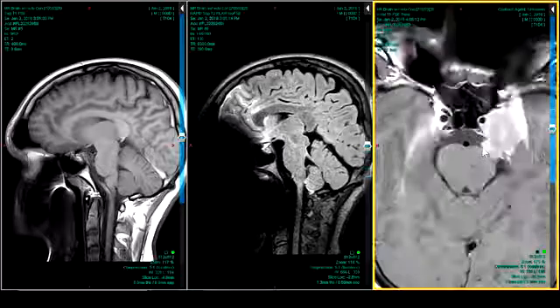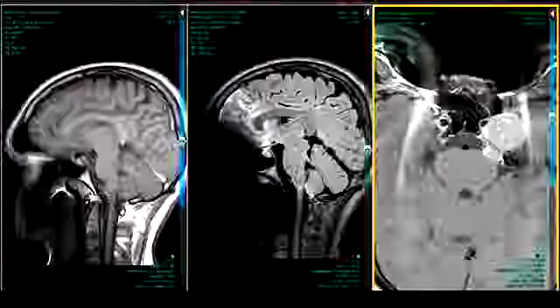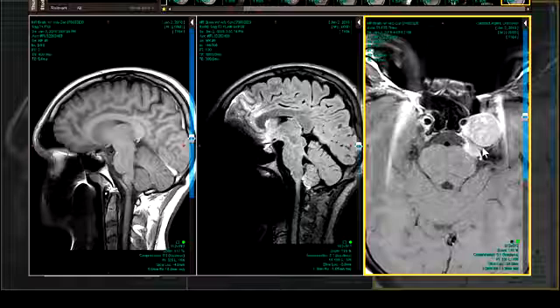If they're talking about a nerve palsy, I like to anatomically go through at some point in the report and say, hey, there's nothing at the bulbopontine fissure, no mass in the clivus, no mass in the cavernous sinus. So they know you're thinking through it.